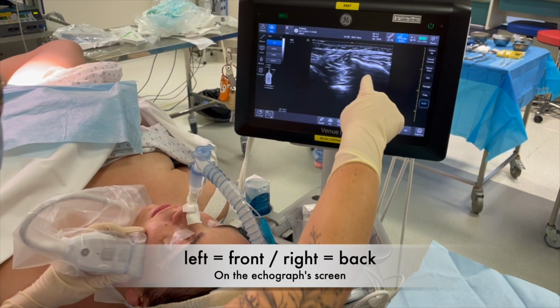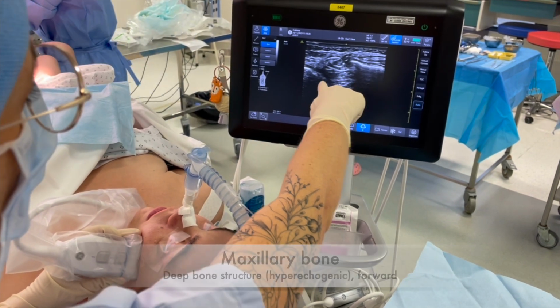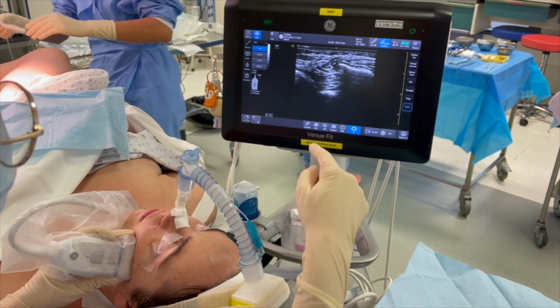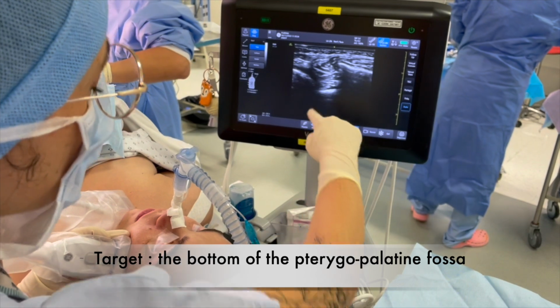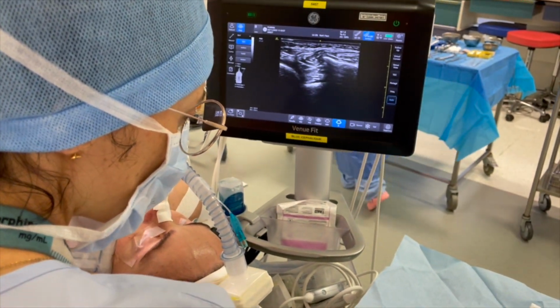On the ultrasound screen, the ascending branch of the mandible, the maxillary bone, and the pterygopalatine fossa are identified as the 3 reference points for the maxillary block.